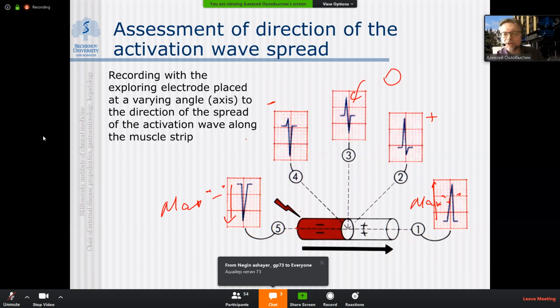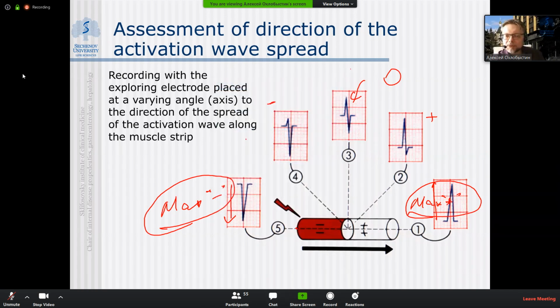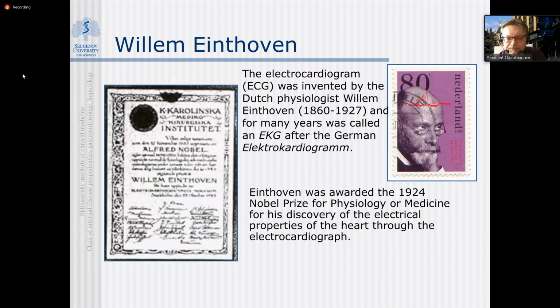Therefore, according to different locations of electrodes, we can predict where from. In that case, we'll get maximal minus, maximal negative. Where to, in this lead, we'll get maximal positive deflection. And perpendicular to which location or lead our activation is going. That is important, and that will be very helpful in prediction of the pattern of activation of myocardium.